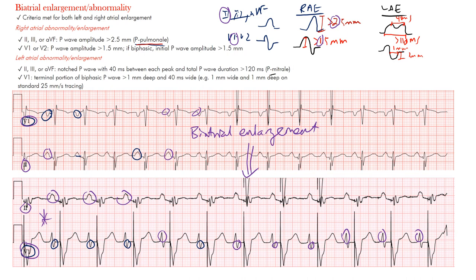To summarize: meet the criteria for both left and right atrial enlargement. For right atrial enlargement in the inferior leads, the P wave is at least 2.5 millimeters and peaked. In V1 or V2, the initial portion is at least 1.5 millimeters. For left atrial enlargement, in the inferior leads look for width and the M-shaped notched P wave — it's mostly about duration.